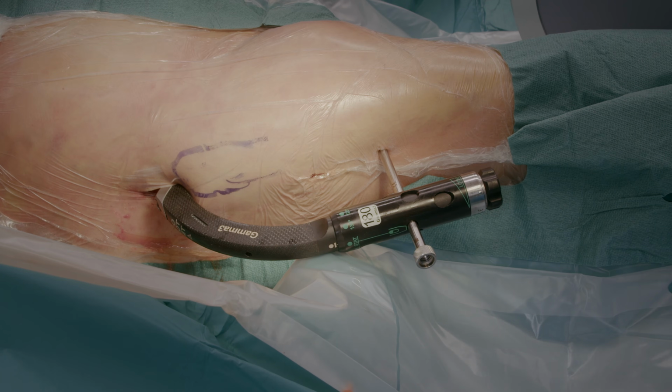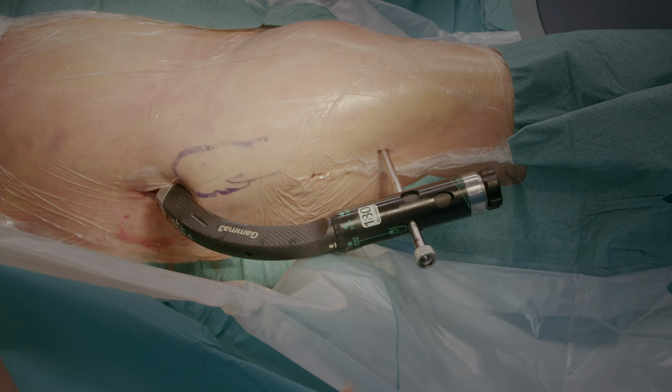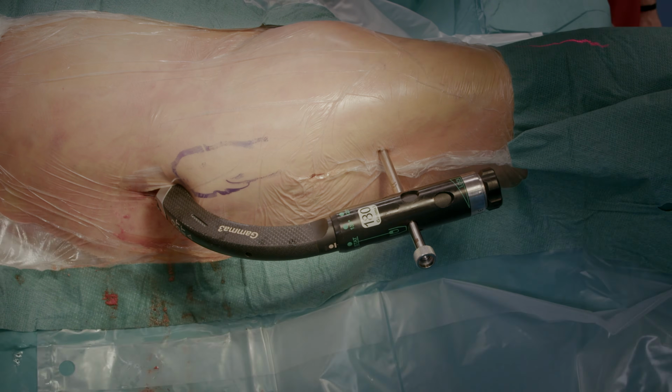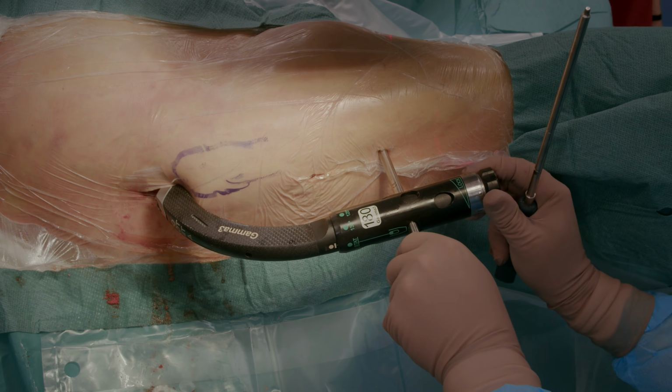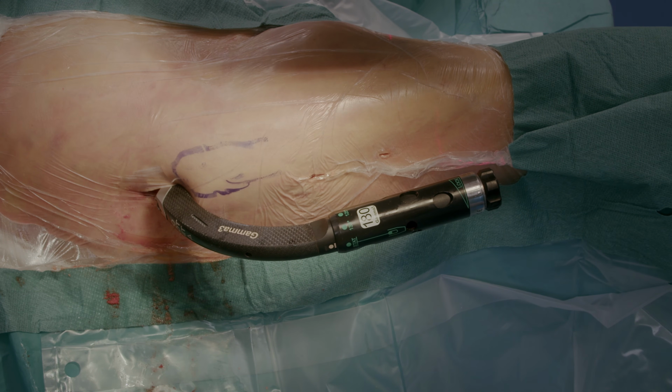Then check from the lateral image that the screw has definitely gone through the nail. The screw cannot be seen at all, so it's definitely gone through the nail. After this, you can start disassembling the instrumentation and start wound closure.